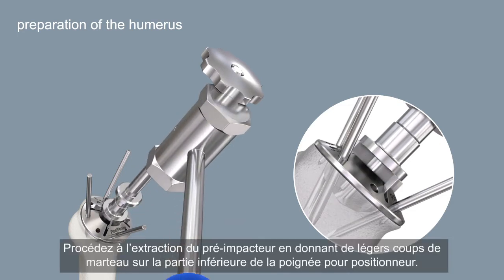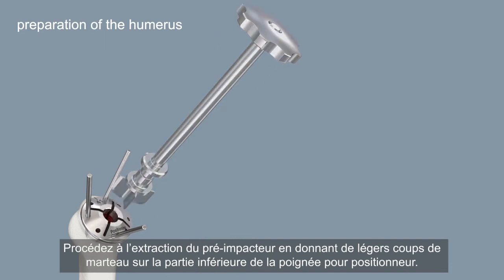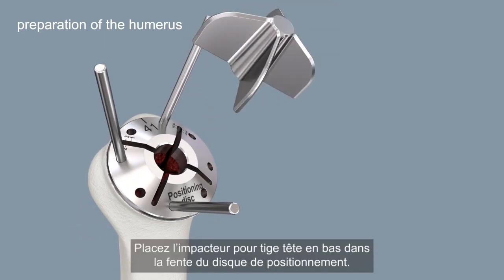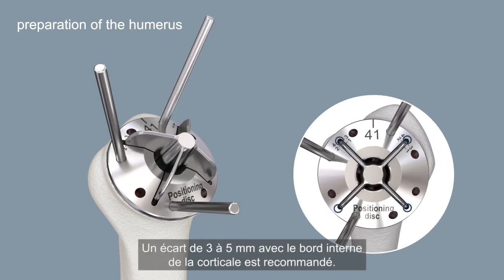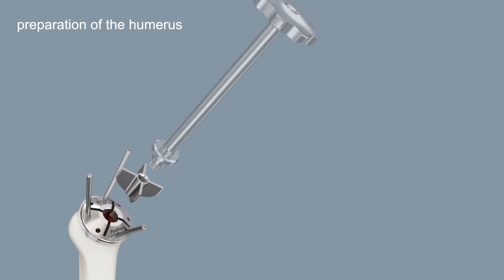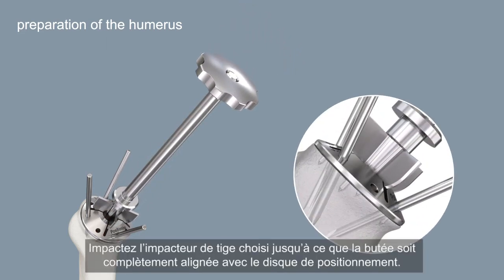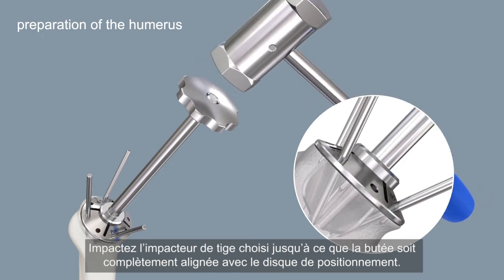Pull off the pre-impactor with slight hammer strokes on the underside of the positioner handle. Place the stem impactor upside down in the slot of the positioning disc. A distance of 3 to 5 millimeters to the inner cortical border is recommended. Drive in the selected stem impactor until the stopper is completely flush with the positioning disc.